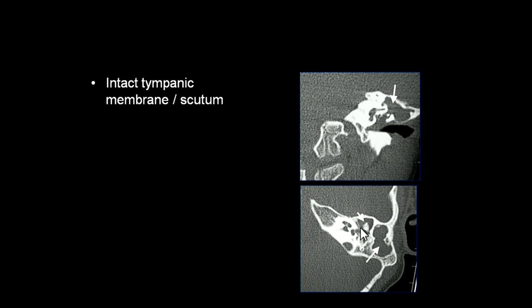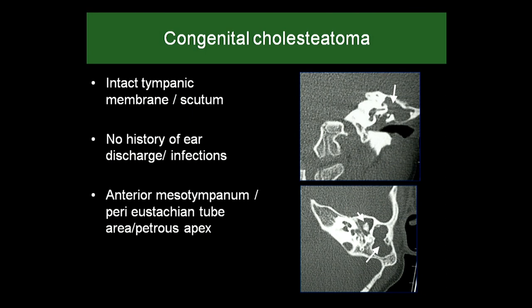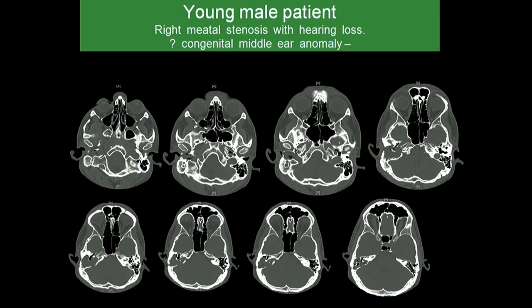Another patient — a child — shows an intact scutum, soft tissue with thinning and expansion of the lateral mastoid wall, and intact tegmen. There is some blunting of the head of malleus. There was no history of ear discharge or infections, but there is ossicular chain erosion. This is where you suggest the possibility of congenital cholesteatoma — in which the scutum is typically intact and there is no history of ear discharge.